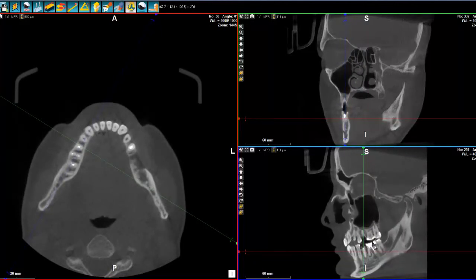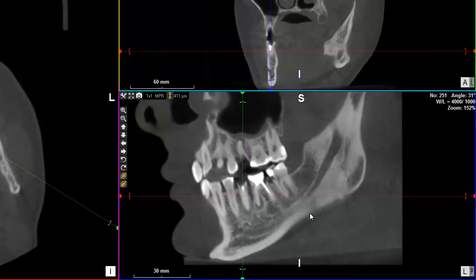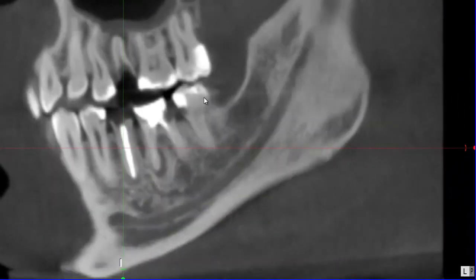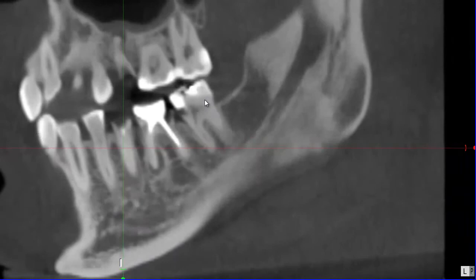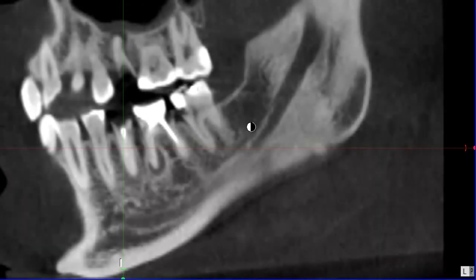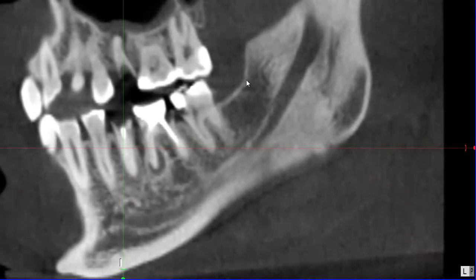And as you can see here, I'm playing with the wheel of my mouse in order to identify it quite clearly. Excellent. So now I can start tracing. In order to help me to have a more precise tracing, precision is important, I could go on full screen and then trace it. That's actually a good idea, so I'm going to just do it like that. And I think we are ready. Just also in order to be prepared, I can check contrast, which I'm doing right now, and let's get tracing.